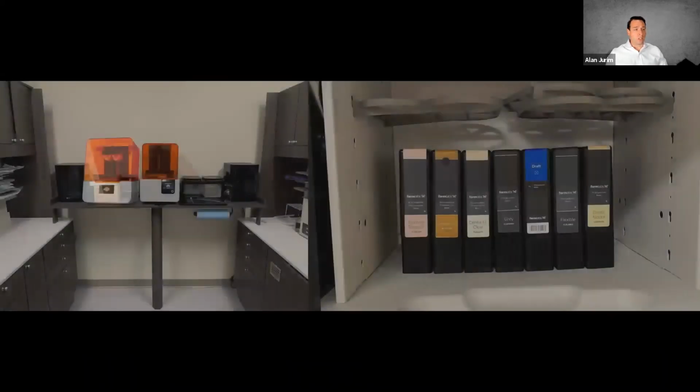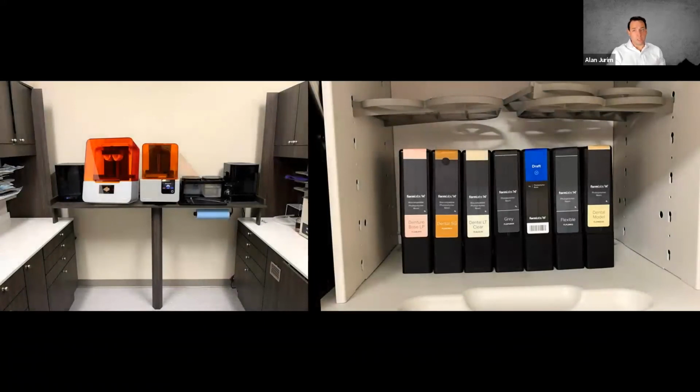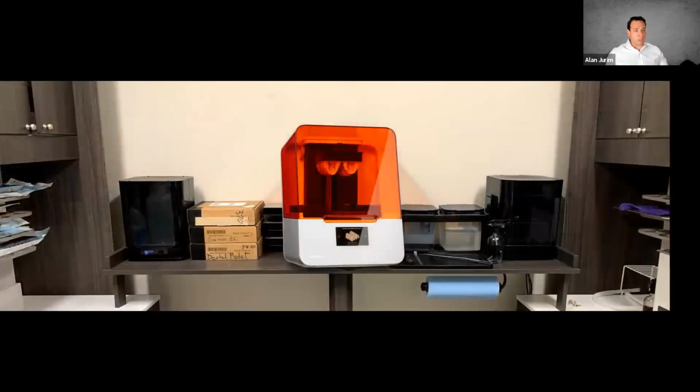So again, with the solution, when we talk about Formlabs, it's not just the printer, right? It's the printer, it's also the post-processing, and it's the materials. When we look at this image here, this is my setup. I built this shelf later on, after I said we need to better set up the system for how we print. First, we have our materials that we keep, highlighted in blue here. We have different tanks that go inside the printer, and the material gets loaded in the back of the printer. So we keep that right next to the printer, so it's easy to swap out the materials.